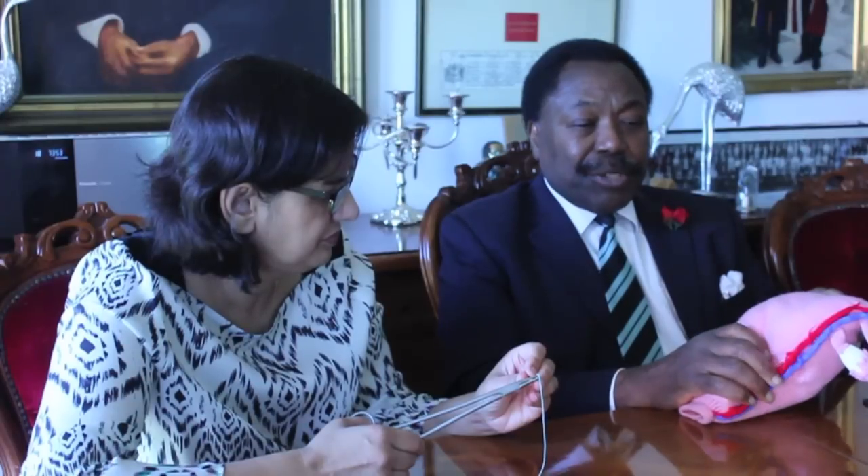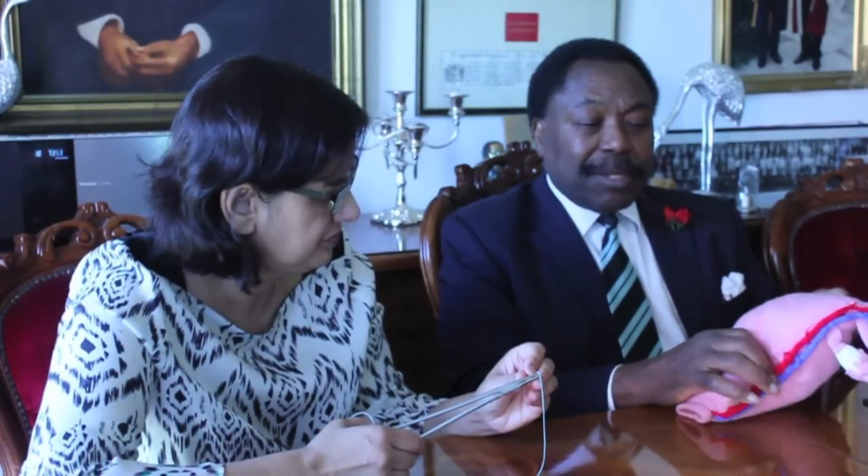After doing that, the uterus is exteriorised — brought out of the body of the patient to facilitate easy access to all parts of the application.